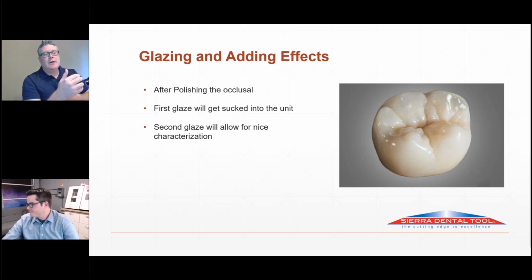There's a lot of times I'll see people glaze a bunch of units, throw them in the oven, they come out, and all the shade is gone to the neck of the crown. It's lost its effects that you're putting into this thing. Take a little bit of time and pride to make this happen, because this is what the patient's getting in there. This is what the patient sees. This is what the doctor is evaluating the work on, is this last process.